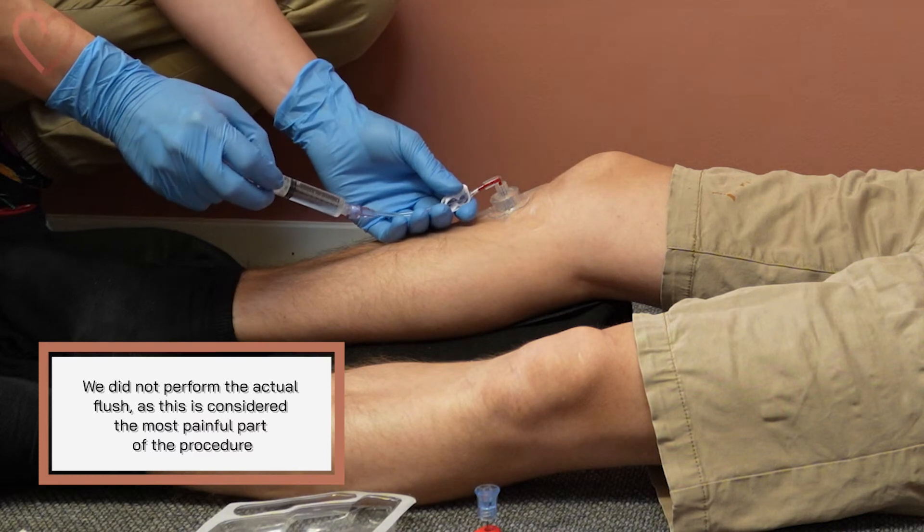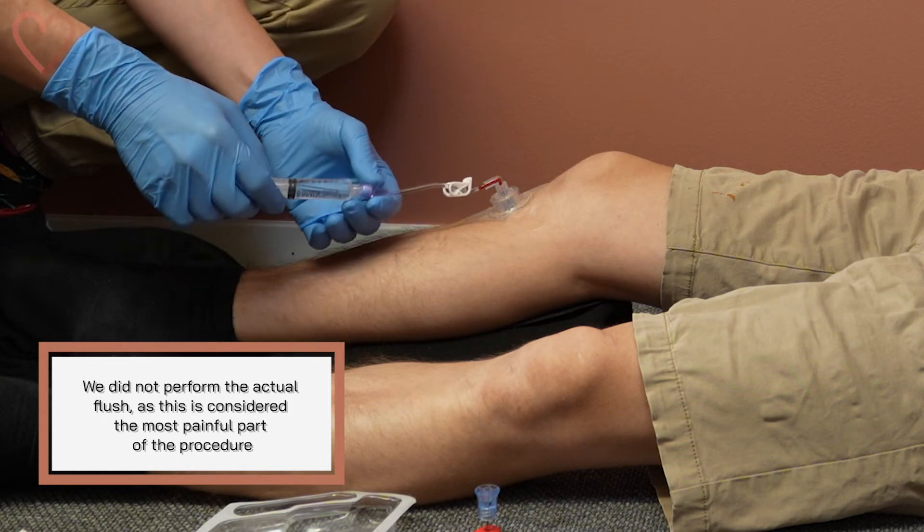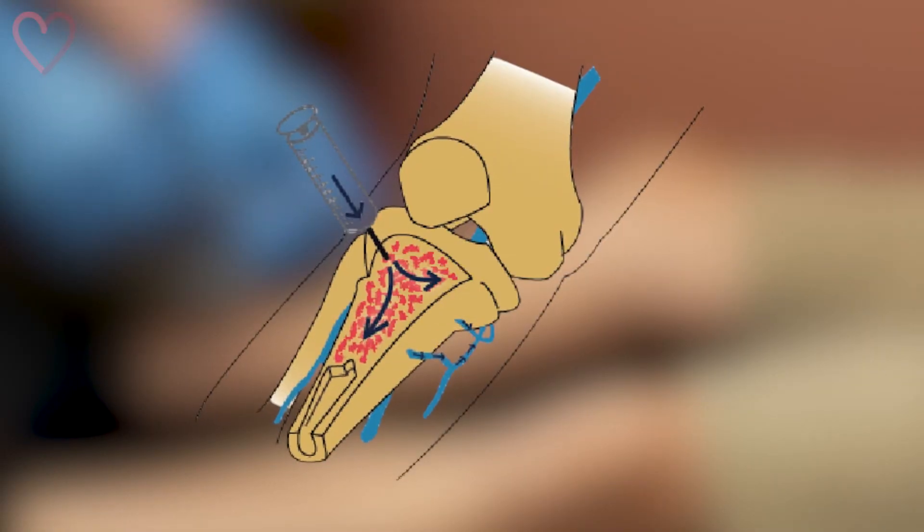The next step is to flush with the syringe with relatively high pressure until you feel a loss of resistance. This flushing opens up the intraosseous cavity, making infusion easier.